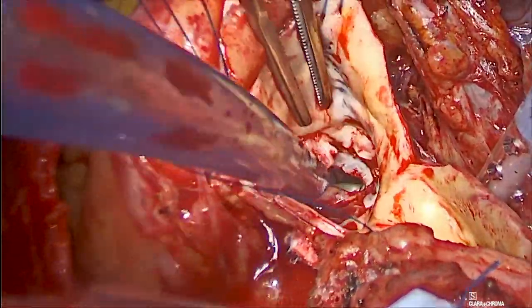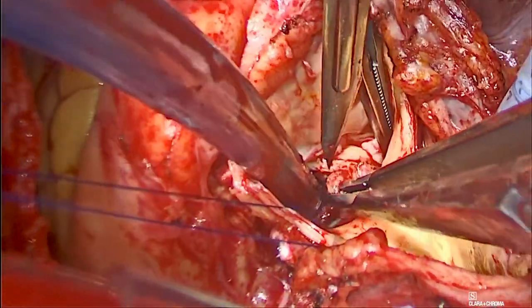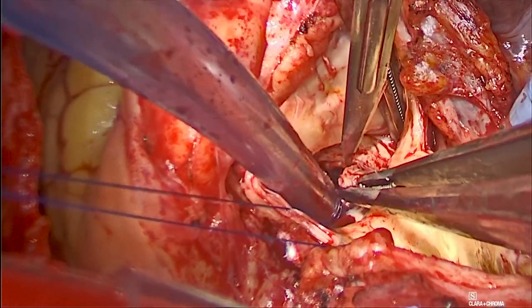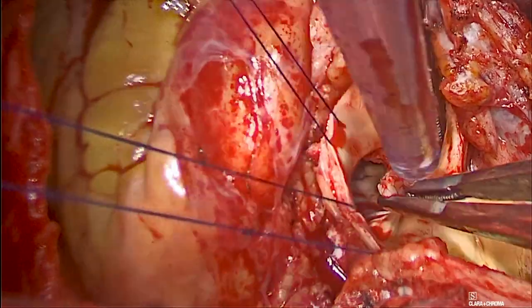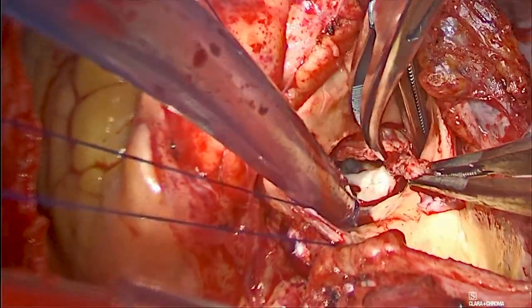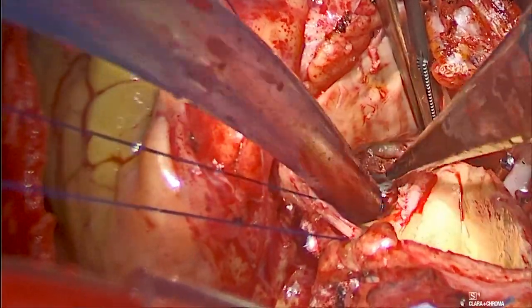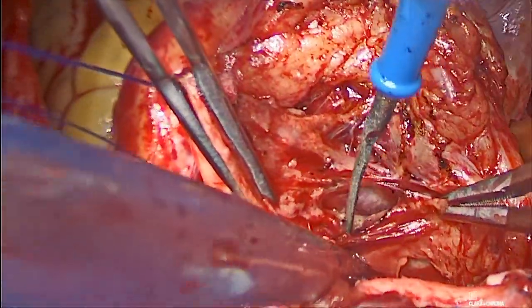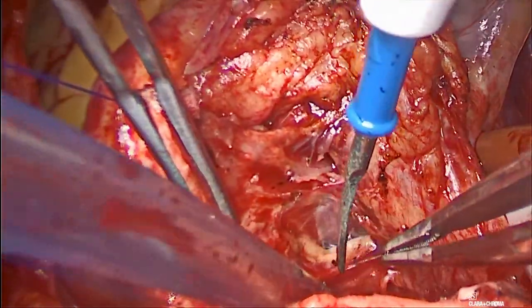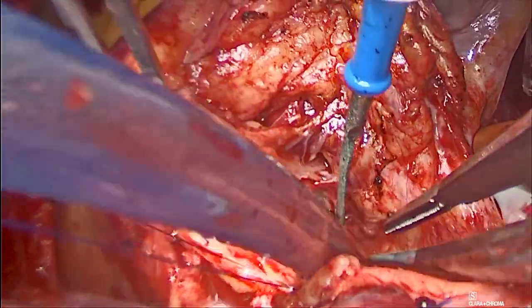Further debridement of the annular sutures was carried out to our satisfaction. In preparation for annular enlargement, the aortic root was dissected all the way to the dome of the left atrium.